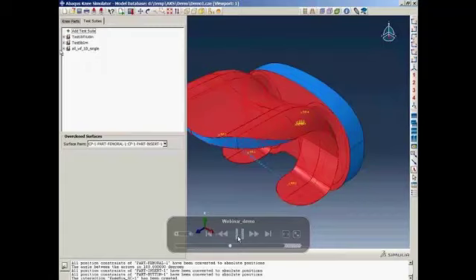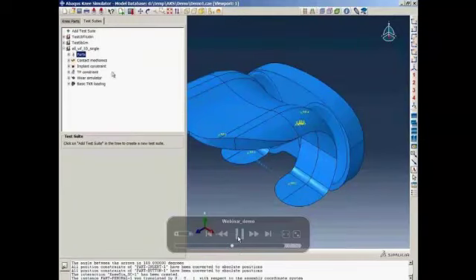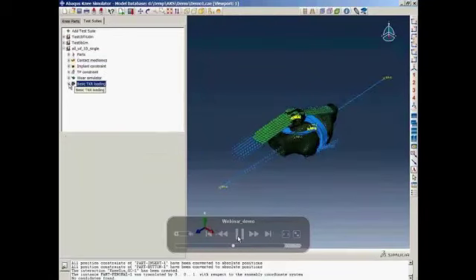Next, I go back to the test suite, right-click on the parts, and I have the tools to move these parts around. So in this case, I just translated the femur components along the Z direction by 1 millimeter. And now I went back and checked for interference again to make sure that the interference has indeed been removed. Now I don't see any interference, so I can go ahead with the simulation options.